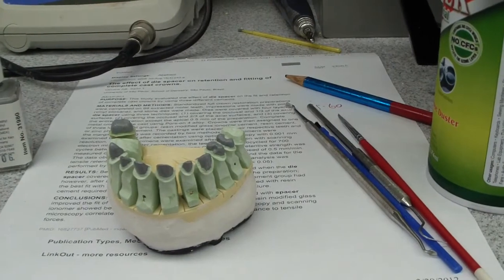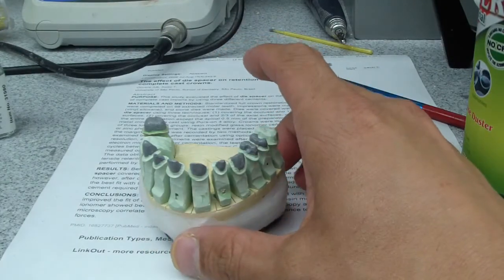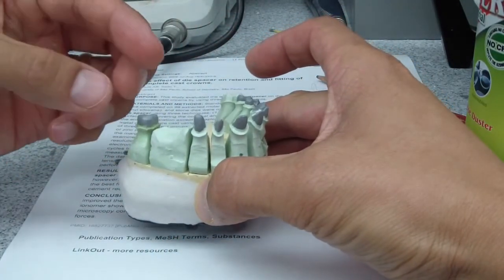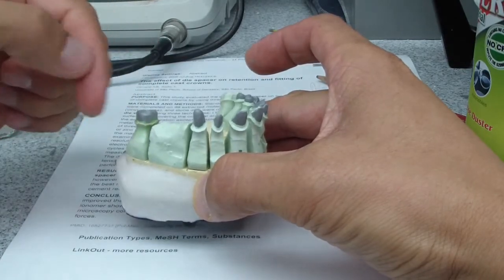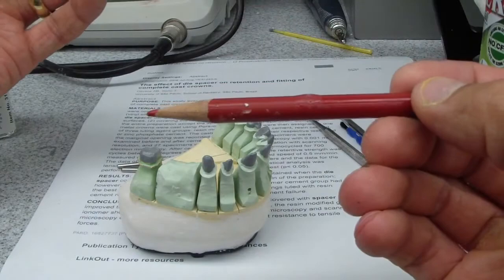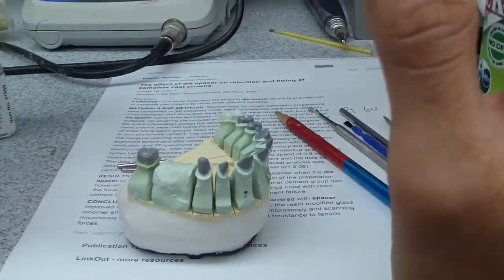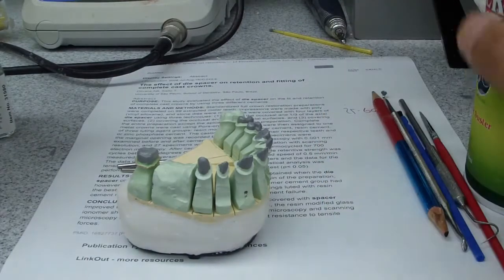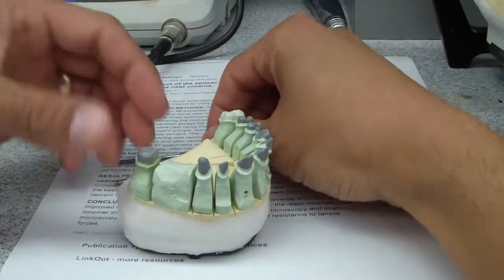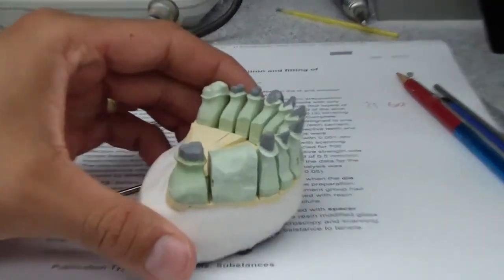Hey, just going to talk about prepping the dies for use — briefly about trimming, placement of the die spacer, the margin wax pencil otherwise known as a pencil crayon, and then some cyanoacrylate. There's a wide variation of ways different folks do it, and reviewing the literature, we'll go from Schillingberg's text and just do a few things here for discussion purposes.